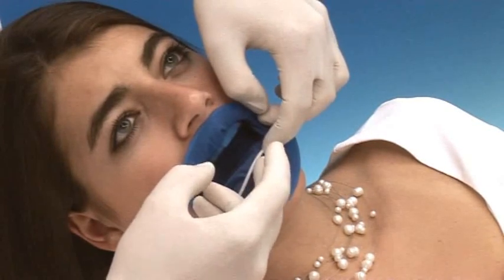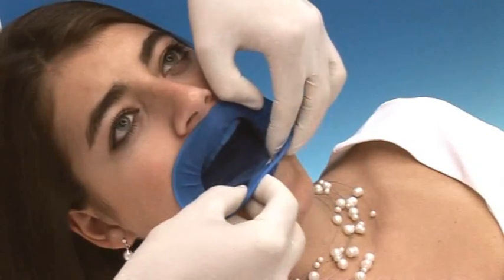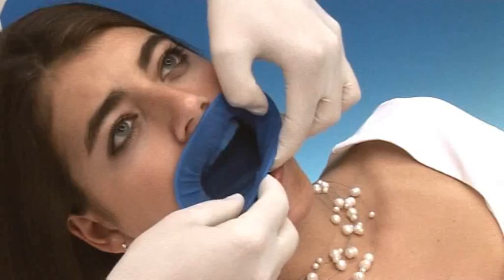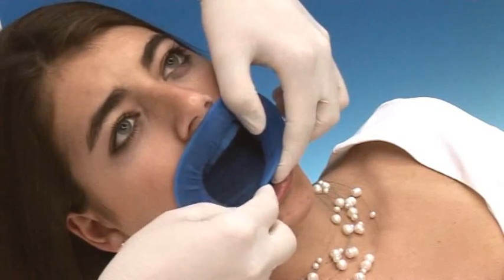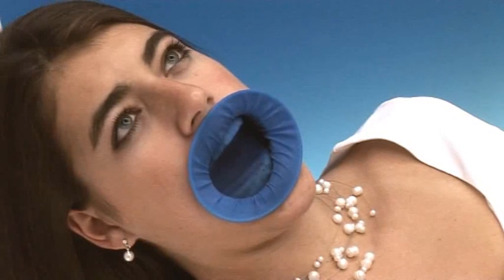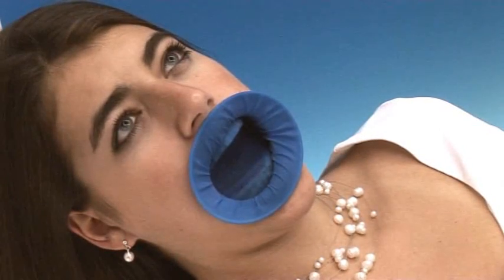In the fourth and final step, the intraoral ring is placed in the fold behind the lower lip. The Optredam now sits perfectly in the fold, ensuring an ideal fit during treatment as well as during opening and closing of the mouth.